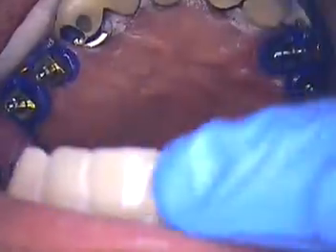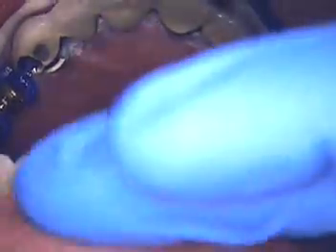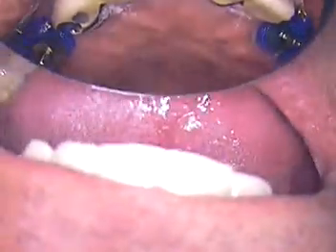On with the Vaseline — just a thin film, that's all that's necessary. We're going to put one more cotton roll right up in the front here. I'm not too worried about material going up on the labial side of his front teeth. And then we're going to sit Frank straight up.